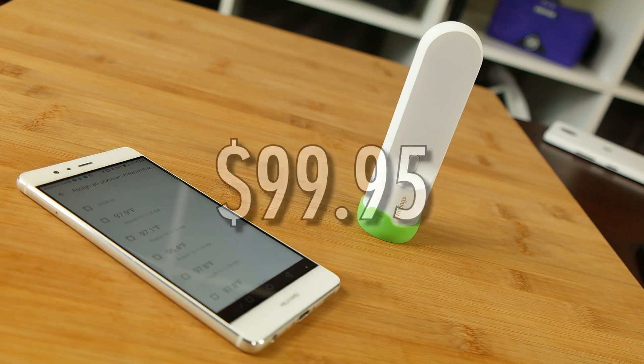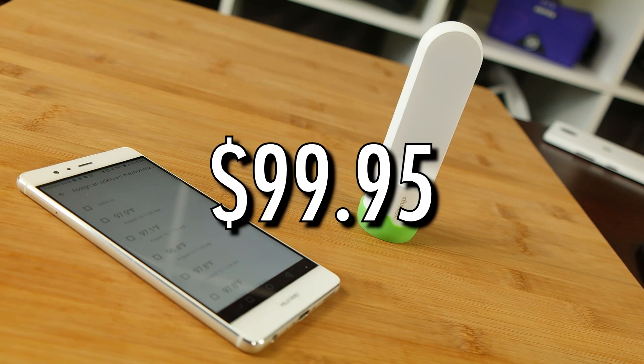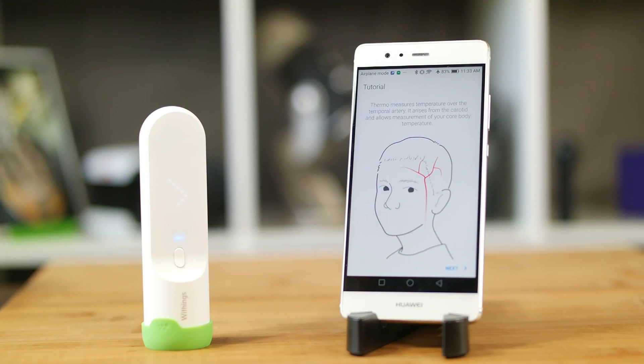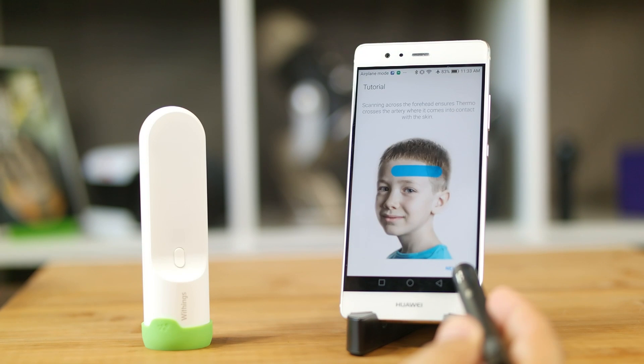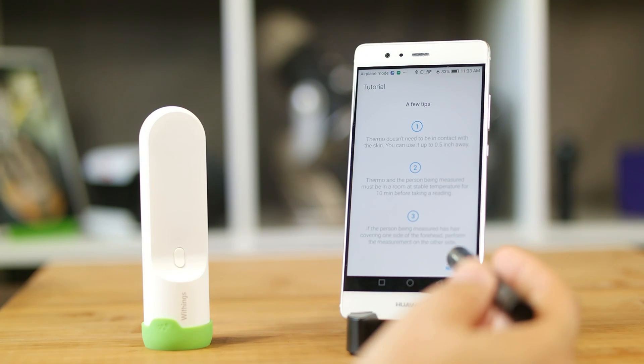This all needs to be balanced against the price, however. At $99.95, it's almost three times the price of a nice non-data-connected, non-contact thermometer. And while this app is helpful, one could make the argument for just creating a spreadsheet on their phone and using Google to look up symptoms and fever treatment options.